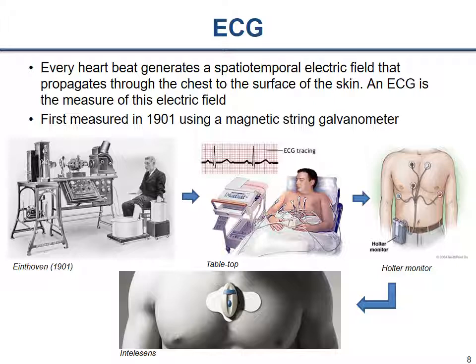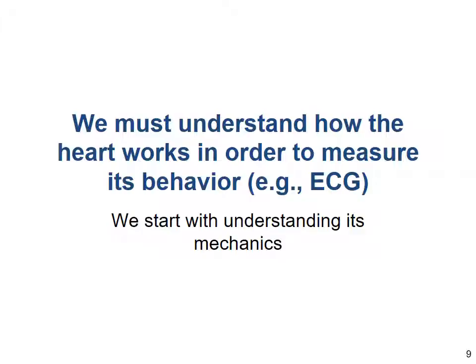But these are useful for capturing some of these more rare types of heart conditions. And more modern, we can start building these very small wearable devices that probably don't allow us to have very good clinical accuracy, but still allow us to capture some amount of information from the electrical activity of the heart that may be useful for certain diagnostic applications.